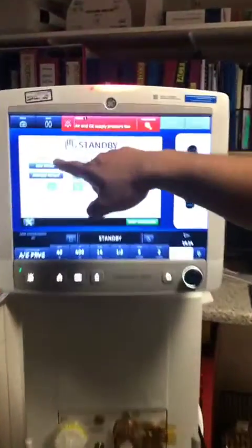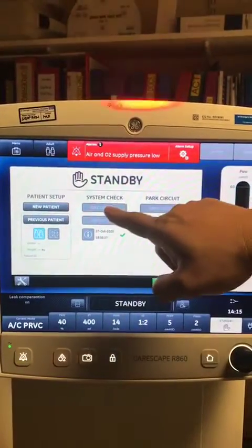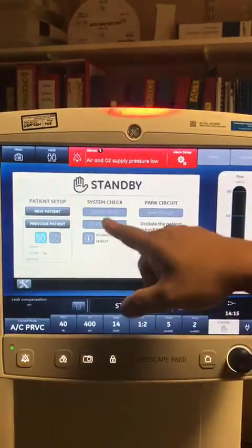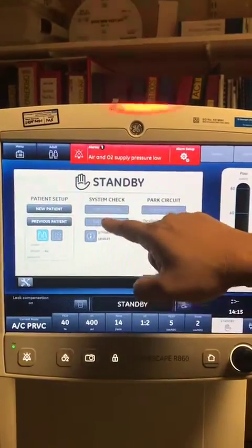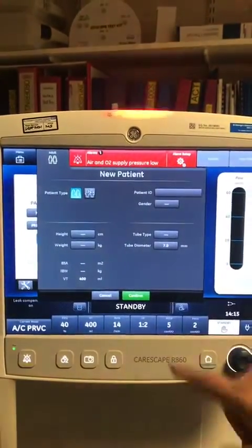When the screen comes up, you've got patient setup options: new and previous. Then you've got system check and parked circuit. You can't do the function check straight away, so what you have to do is go to new patient and press confirm.